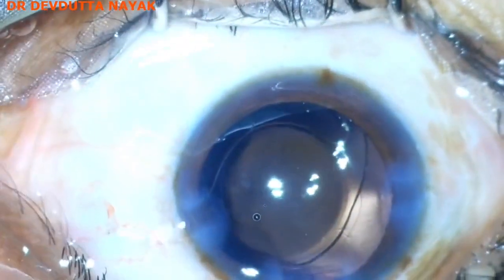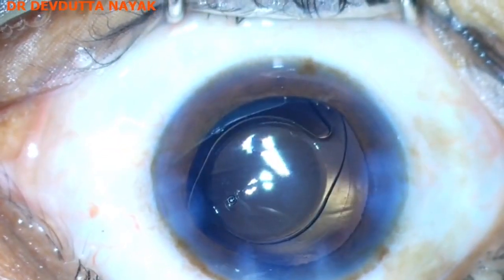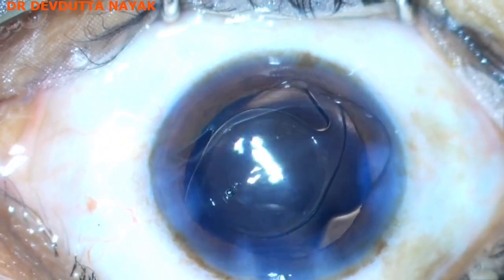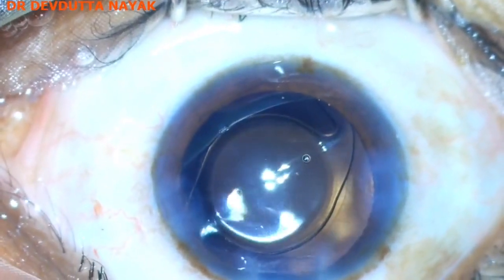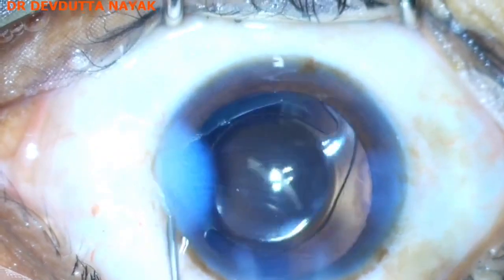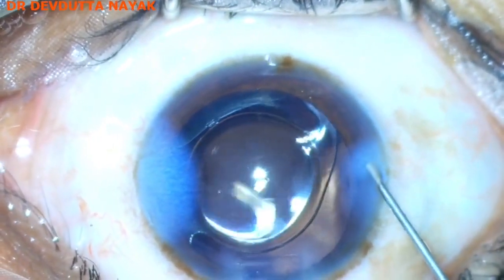A little bit of intracameral moxifloxacin is instilled, followed by BSS to hydrate the side ports and the main wound. The case is almost over. Thank you very much for watching.